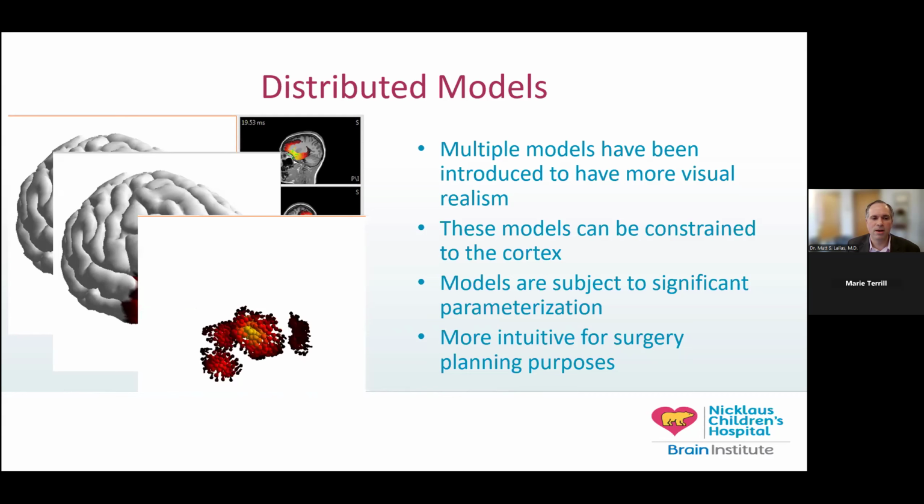Another way of thinking about it is essentially like this is just a whole bunch of little dipoles in little voxels. And because of this, some of them are actually mapping it out as a current. And now you've got a current in a voxel. So they say that's a current density. So a lot of them are referred to as current density reconstructions.